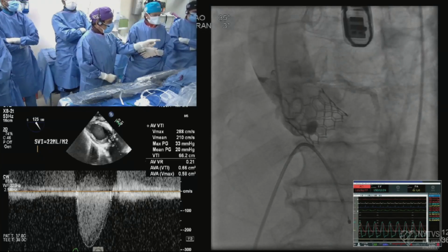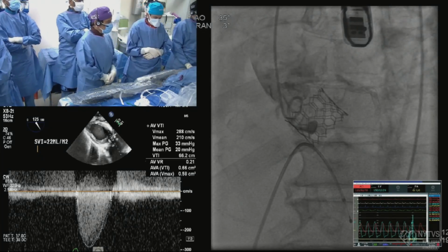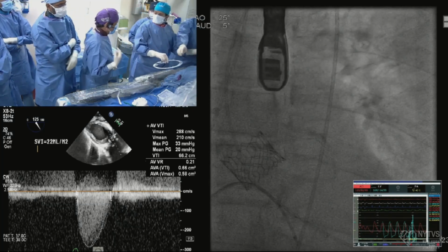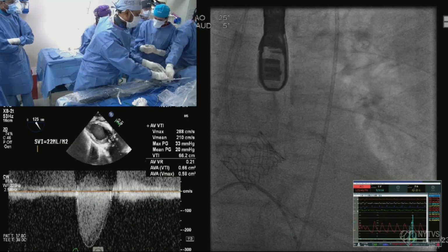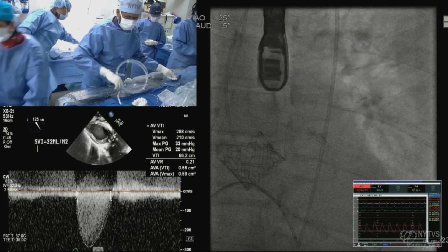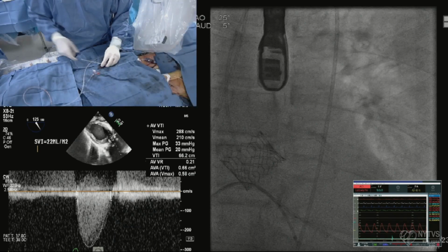All right. So where are we now? We're ready to. Yeah, so it dropped in. So we dropped in. So the valve went. That's good. The pigtail went in directly. Now you can use this. So any thoughts on the panel in terms of anything we would do differently? What's the strategy now for implant? Hey, Gilbert, would you guys have considered doing pre-dilatation of the Sapien valve?